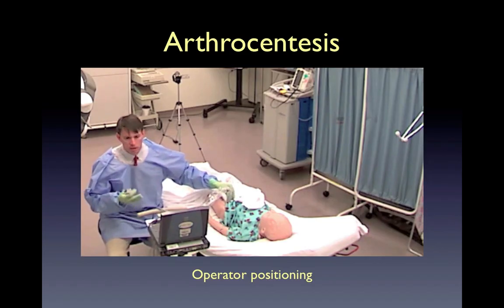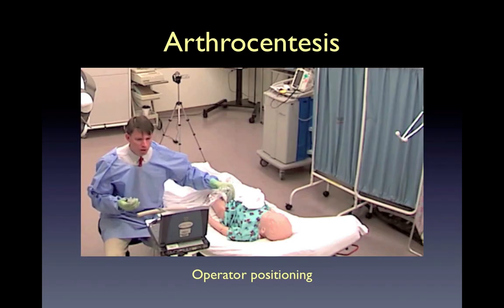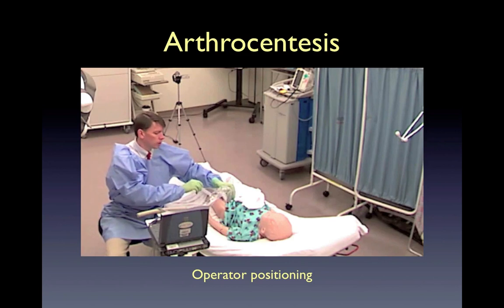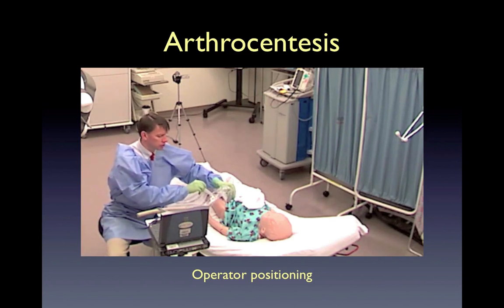Once the hip and synovial space have been brought into view, the operator can aspirate with the needle in plane with the transducer, inserting the needle from inferolateral to superomedial.